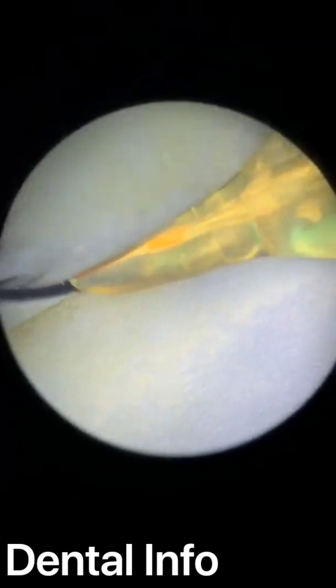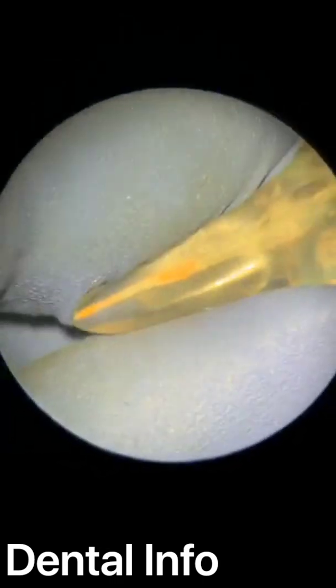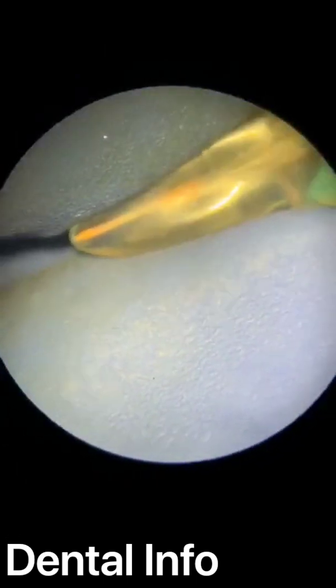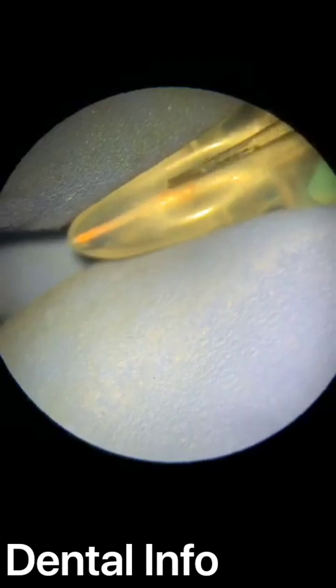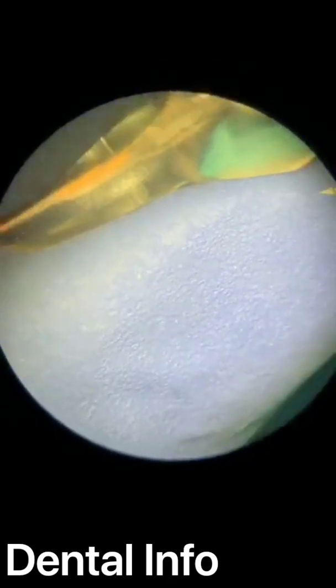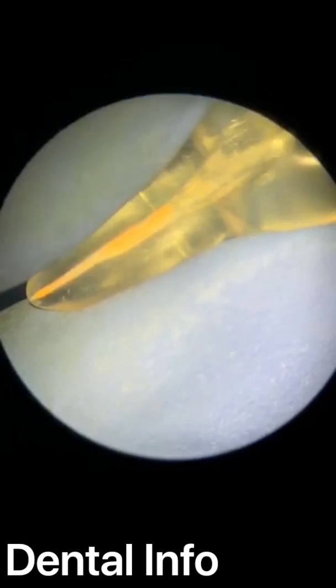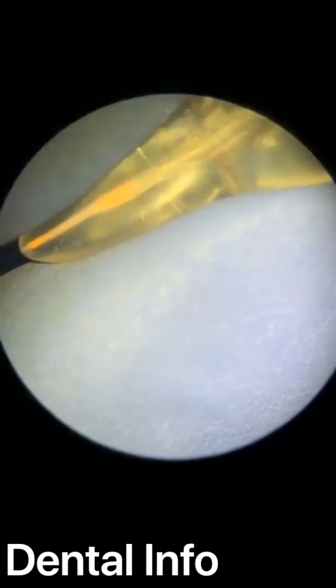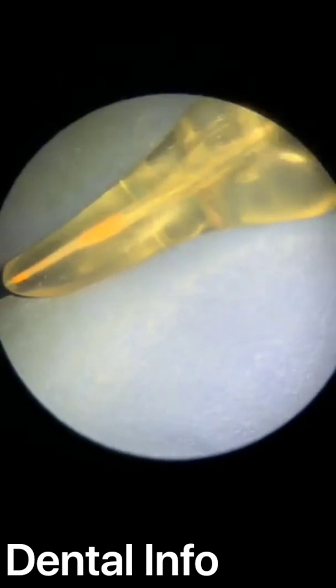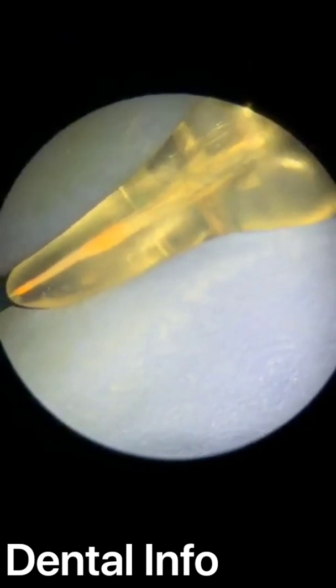See? I'm compacting my gutta percha with plugger, with cold plugger. No heat here, unless I want this heat. If I don't want this heat, I will not. If I don't want this gutta percha, I can cut it out. I removed some gutta percha, and I am here condensating. I'm taking from the walls, collecting the gutta percha from all the walls, and going down. So I don't have now any gutta percha on the walls. All gutta percha is vertically compacted.